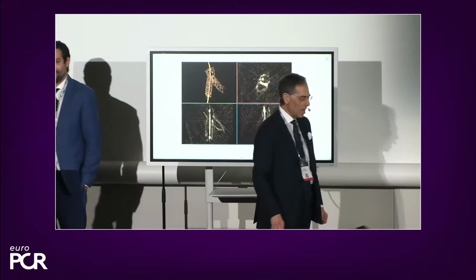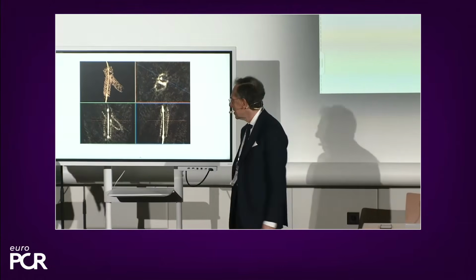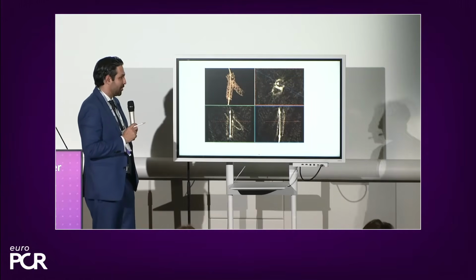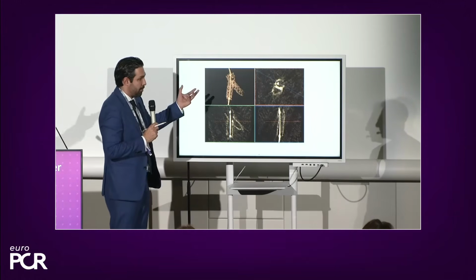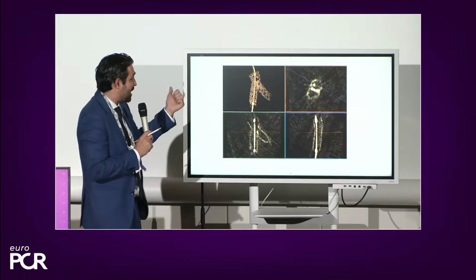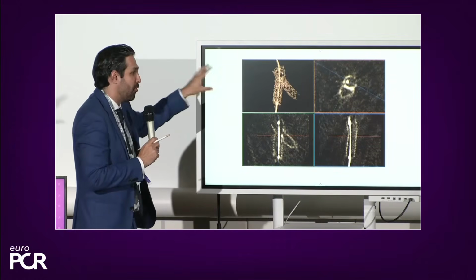Potentials. Somebody said, well, we are going to use... Dejan was asking yesterday, pushing a lot, I said, cool down a little bit. So bifurcation, for instance. I think that this is one of the niches where we see this technology providing a lot of benefit, understanding the morphology of the bifurcation, first in terms of calcification, location of the calcification relative to the side branch, then understanding after stent deployment how the stent was actually expanded in the different parts, main proximal vessel, carina, etc.